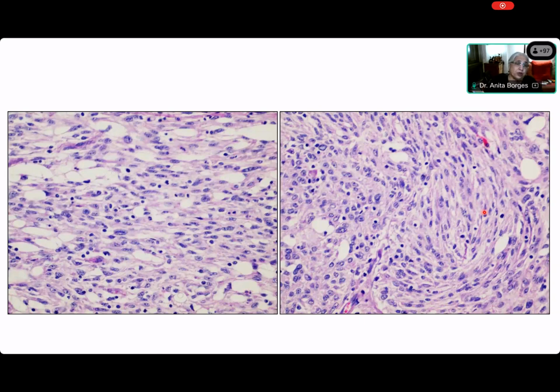Now, would you consider this cellular, like in a synovial sarcoma or in that other tumor, which was NTRK positive? Yes, Kedar? Not as cellular as synovial sarcoma. In fact, there are large gaps here and there, right? Where the cells are not there. There's a certain amount of pleomorphism. You see these nuclei? So if anybody wants to tell me that this is a synovial sarcoma, I will say no. Monophasic synovial sarcoma has no pleomorphism at all. Please take that as a given. And here you're seeing some pleomorphism.